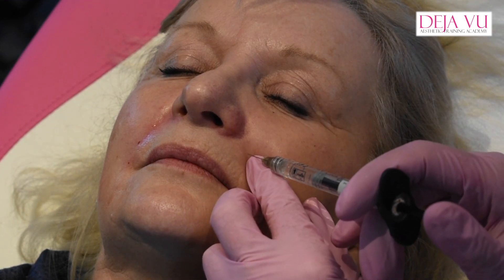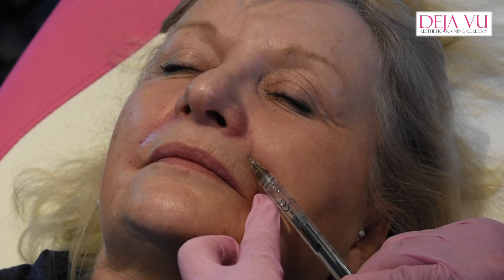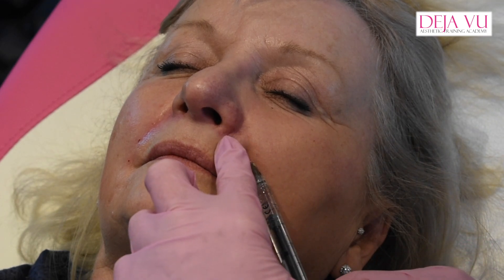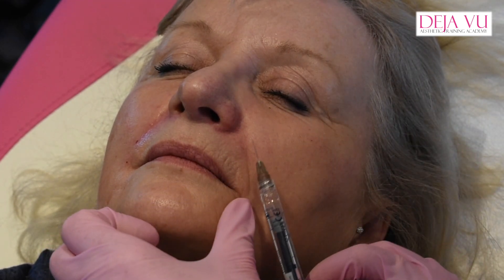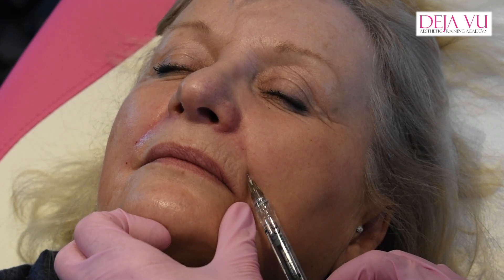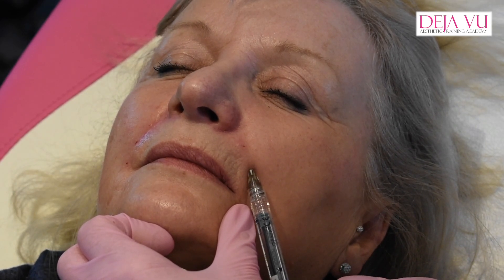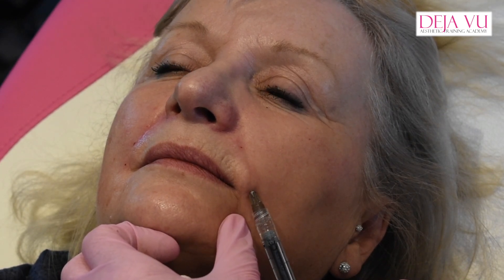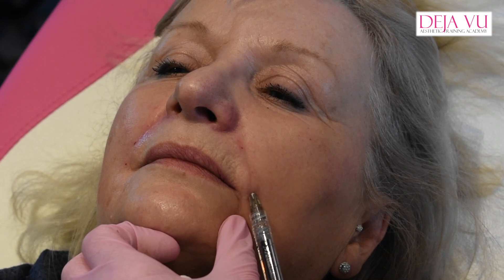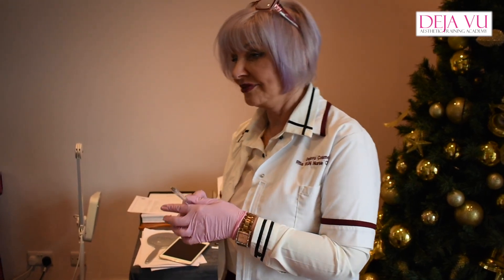I'm measuring again. Going in at 90 degrees, a little scratch, through to the needle, angle it, and up you go. I'm using volume at the moment, so it's a little bit thicker, therefore it's going to go further for me. That's that one done. Sometimes you only need to just do that triangle and it's enough because they haven't got the lines going down there. Everybody's different in what they have done.